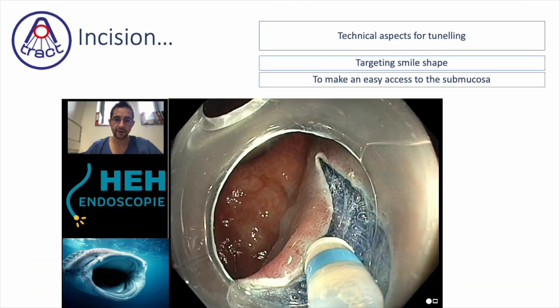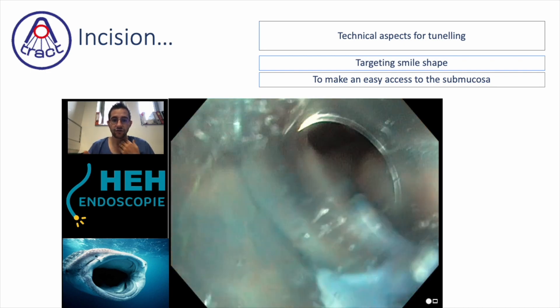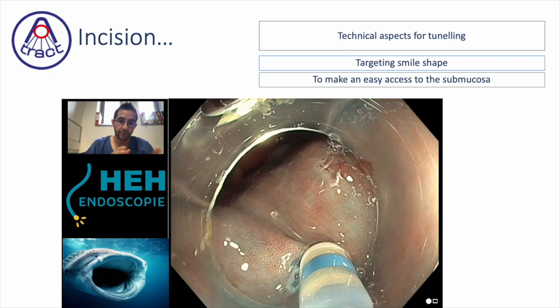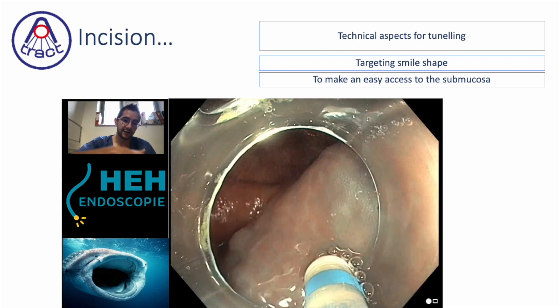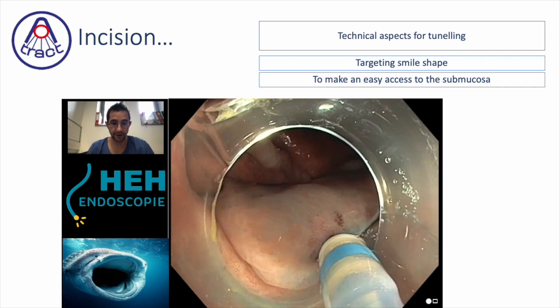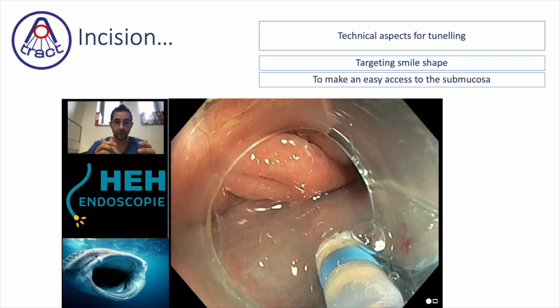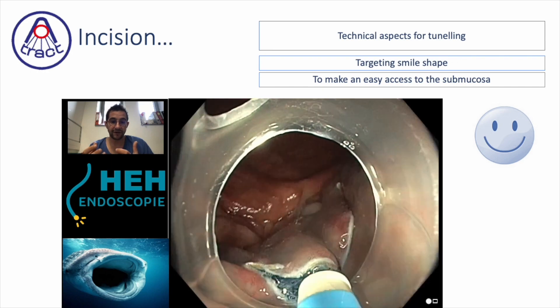The target is to obtain a smile-shape incision, because it is the most helpful incision. You will have to enter into the submucosa for the properly named endoscopic submucosal dissection, because for the moment you are not yet into the submucosa. You should enter it and place your scope in the submucosa, but to reach the submucosal space you should do your incision. If you do something which is not a smile shape, the area to enter the space will be very small, not letting your scope get into the submucosa.